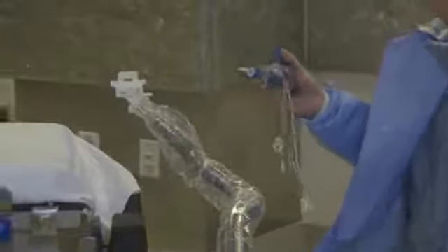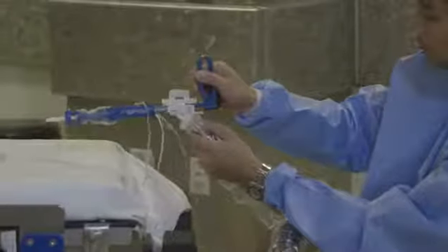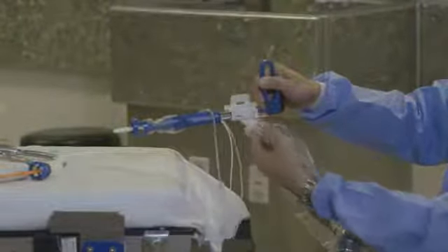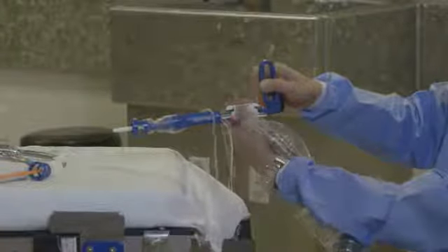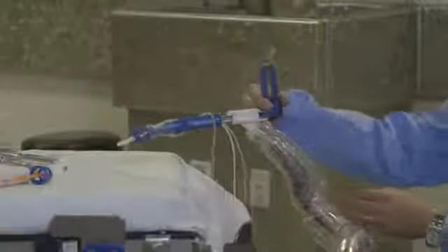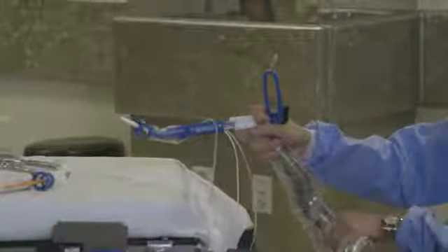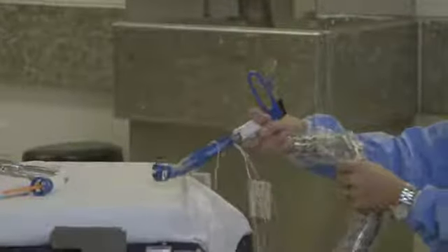So let's mock this up here. Let's say that we've got this in the patient, and I'm going to make my subtle adjustments. It's going to sit in there. You can see that it fits in a distinct groove. I'm going to pull the clamp down, and you can hear it clip into place, and now it's secure. And then again, I typically will hold both at the same time, and it just allows me to have a greater sense of control over how I want to position this when it's in the patient.